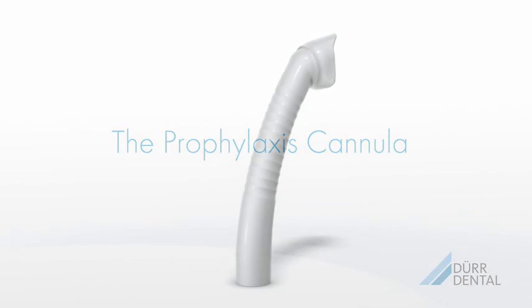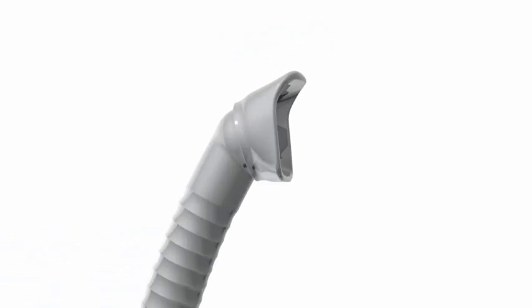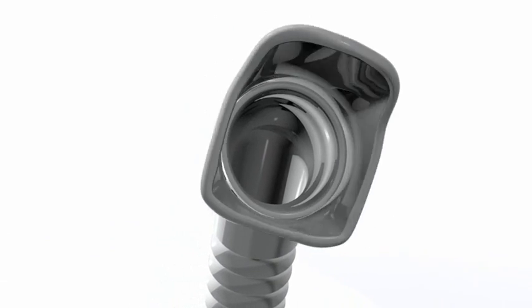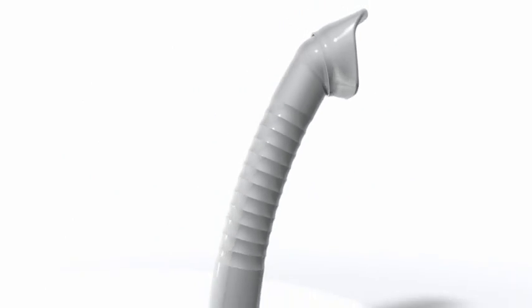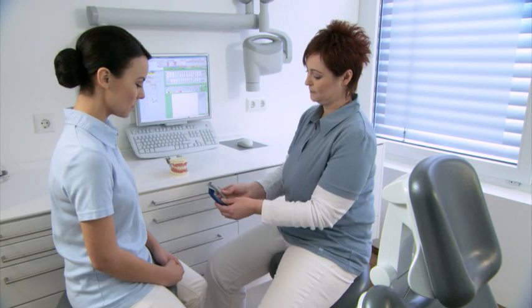The ergonomically designed Prophylaxis cannula, with non-slip surface, is equipped with a unique protective shield. The protective shield can be rotated and set to the desired angle, thus enabling very effective aspiration of aerosol.